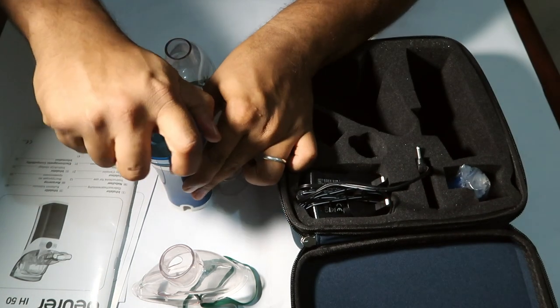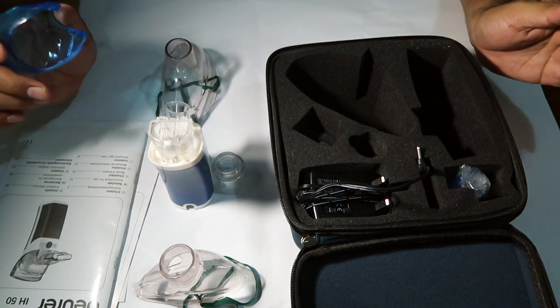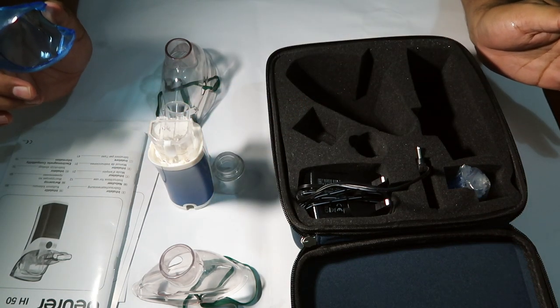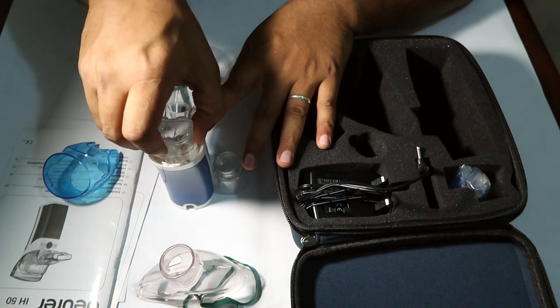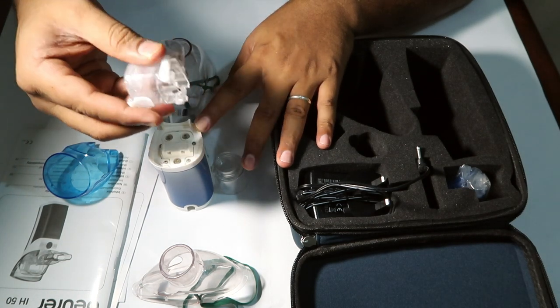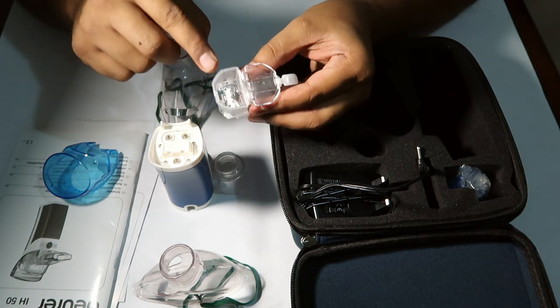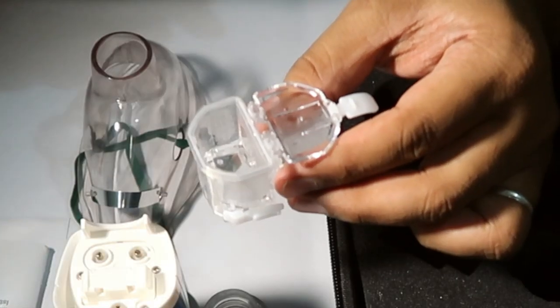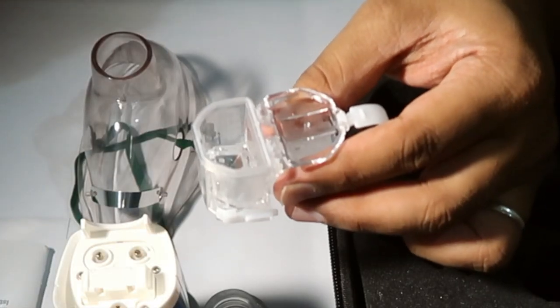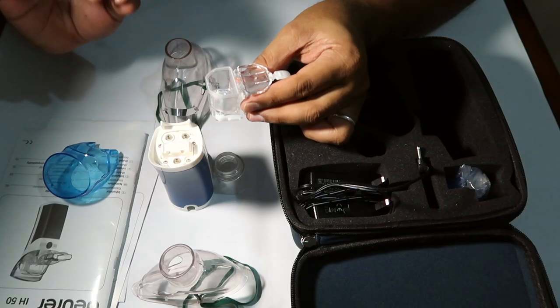This is how we use it. We have to clean the water and remove it. This is the medicine container. I don't have any medicine here, but this is how we use it.